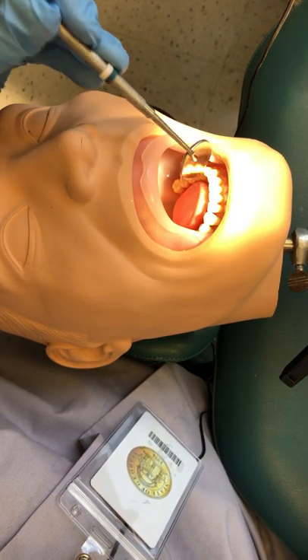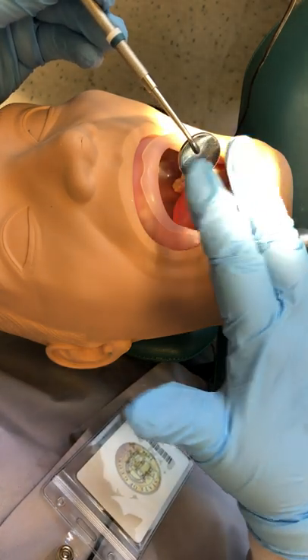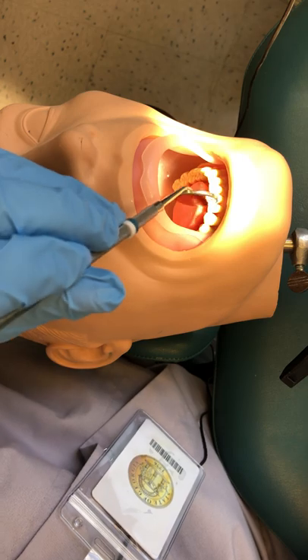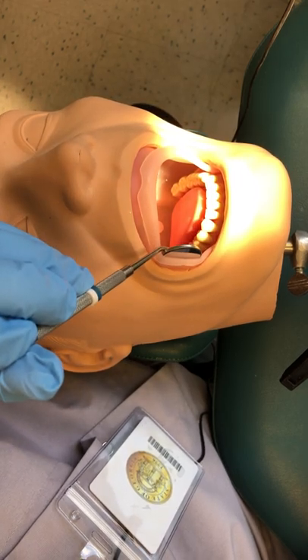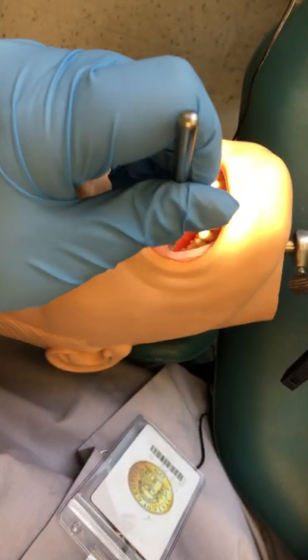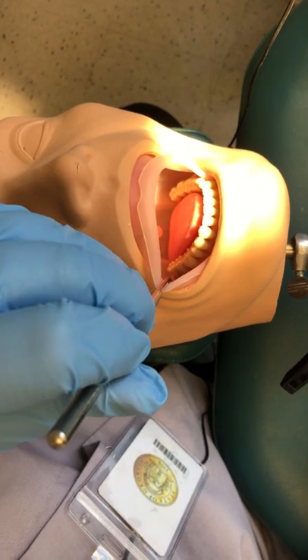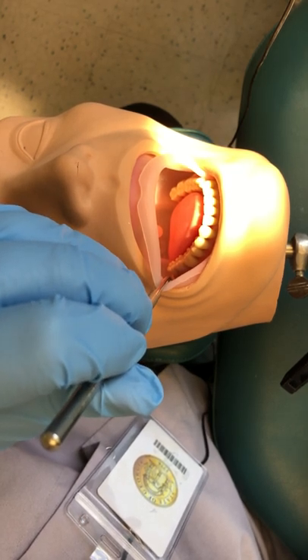They do make double-sided mouth mirrors — they're not very common, but they have a reflective surface on both sides. When retracting the cheeks, don't be afraid to get your mirror really into the oral cavity so you have a good grip and can pull that cheek towards you to retract it.